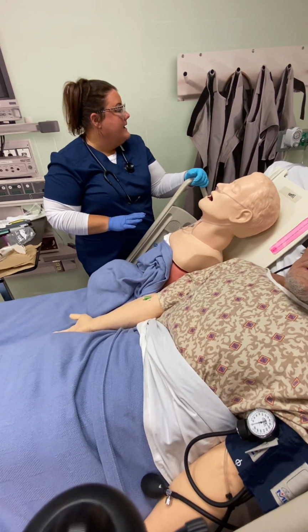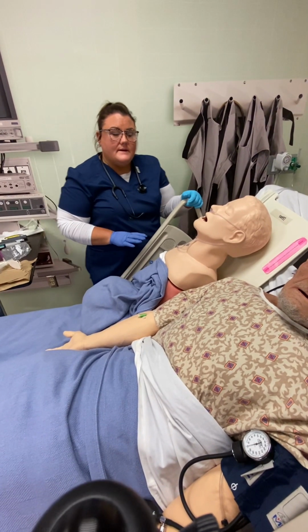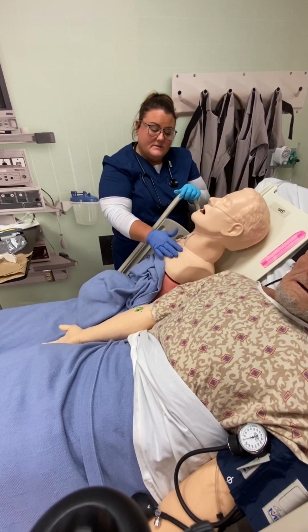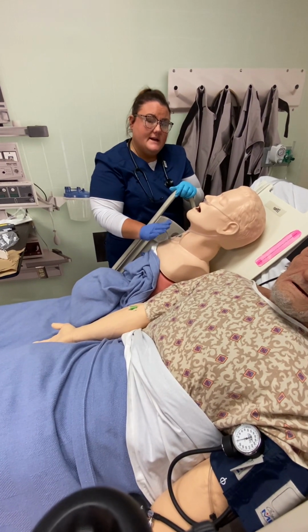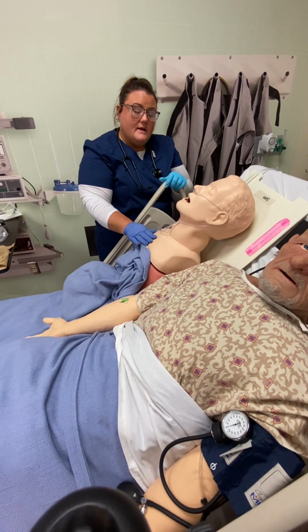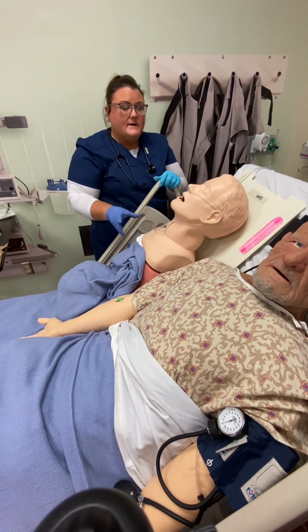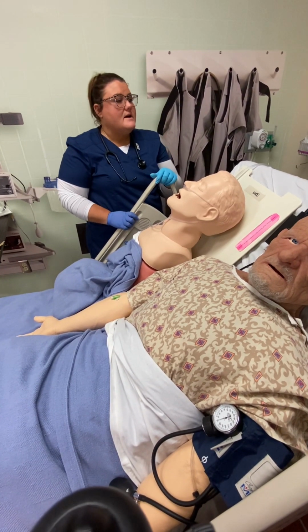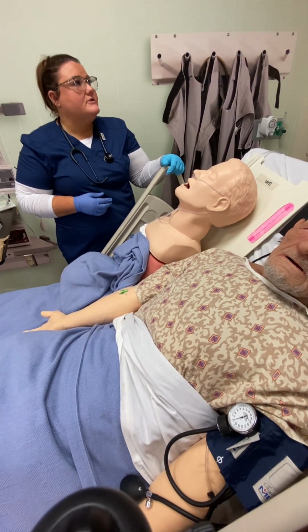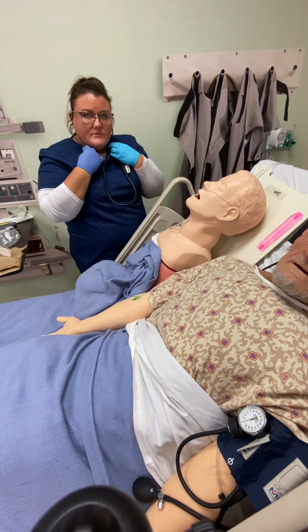So I would go ahead and let him know that I'm gonna grab a bubble humidifier. I would notate his work of breathing, make sure he's good, he's not in any kind of respiratory distress. And once I make sure he's not in any respiratory distress, and I've reassessed him, so I just listened to his heart rate, blood pressure, SpO2, respiratory rate, and listening to those breath sounds again.